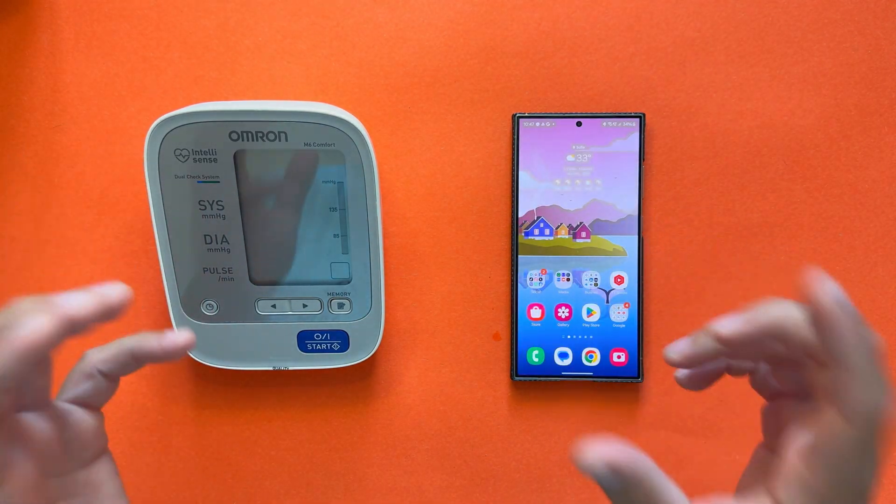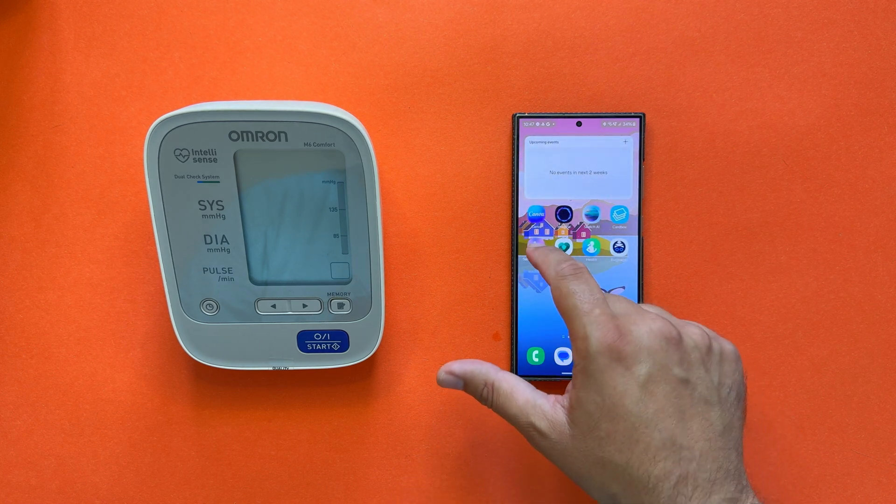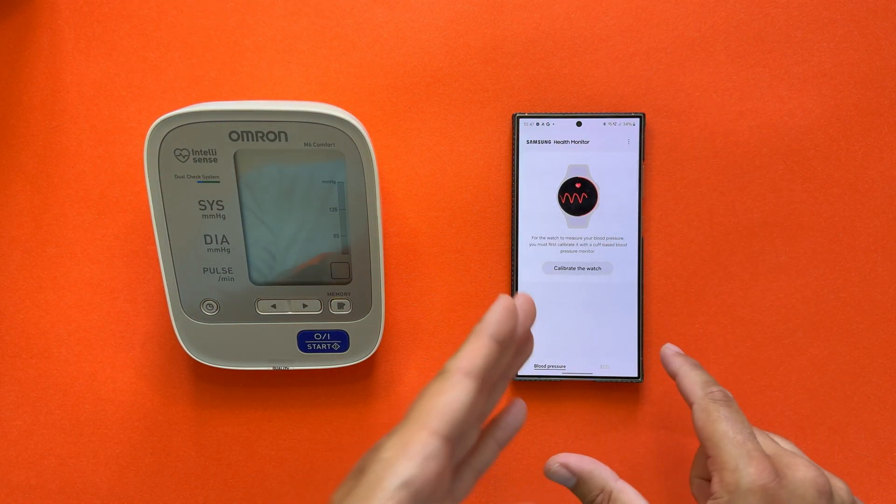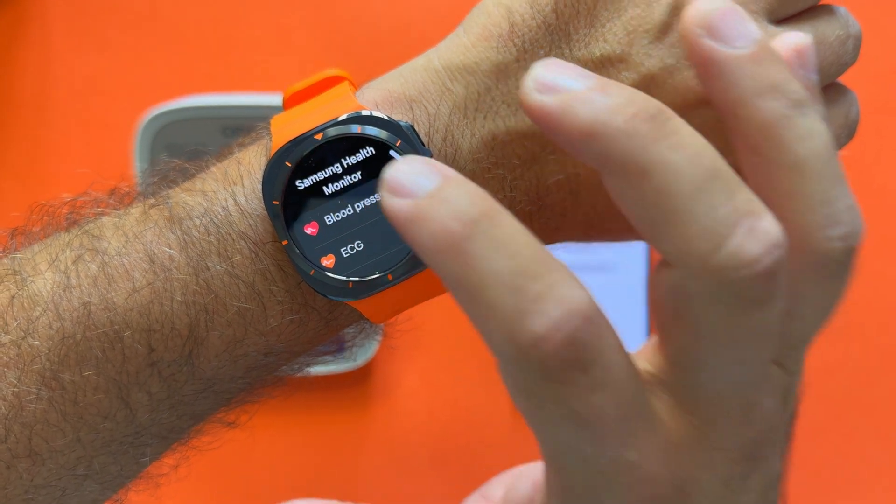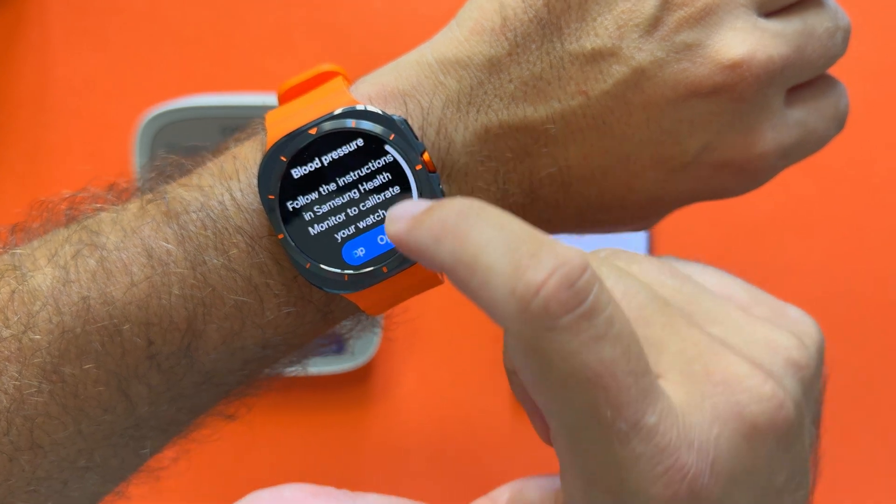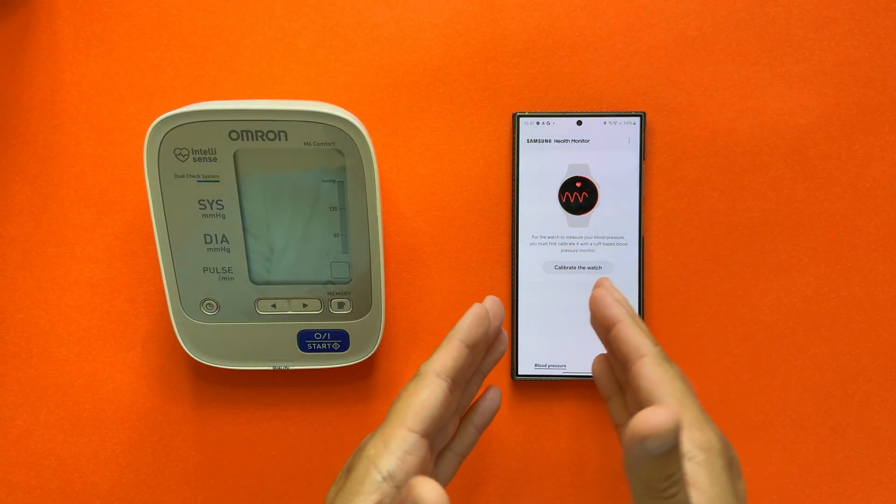But how does that work? First you need to download Samsung Health Monitor. Samsung Health Monitor has two options: one is the blood pressure, the other is the ECG. If I click on the blood pressure, I'm going to get this message: follow the instructions in the Samsung Health Monitor to calibrate the watch. So you need to open that up.